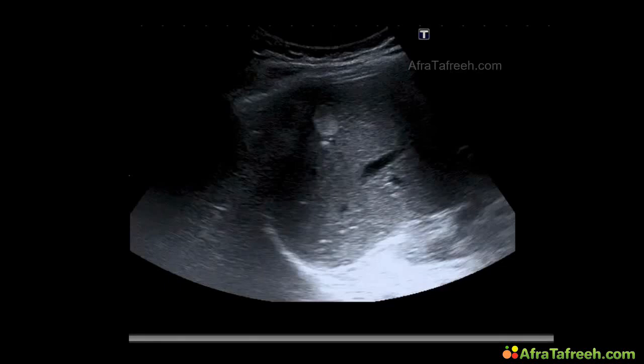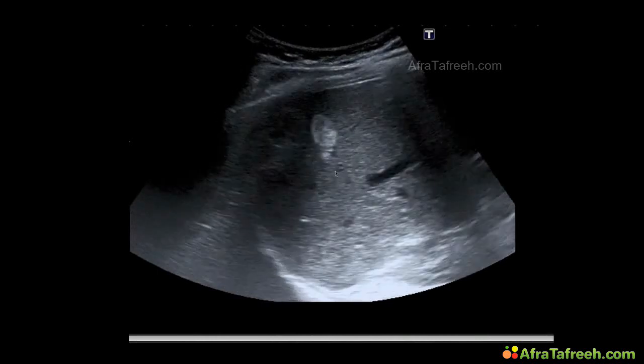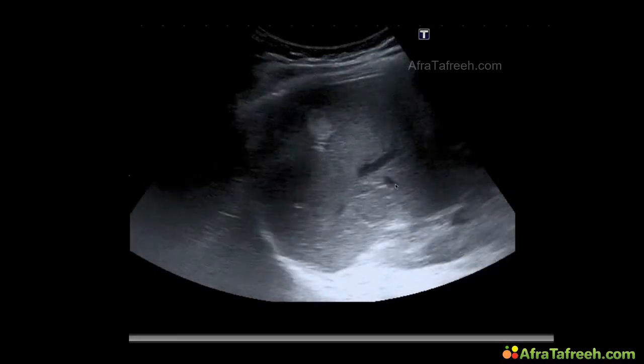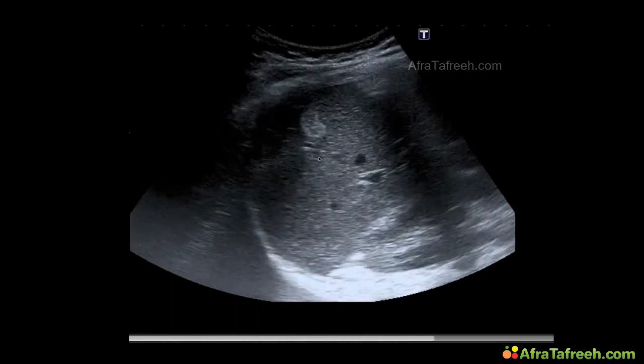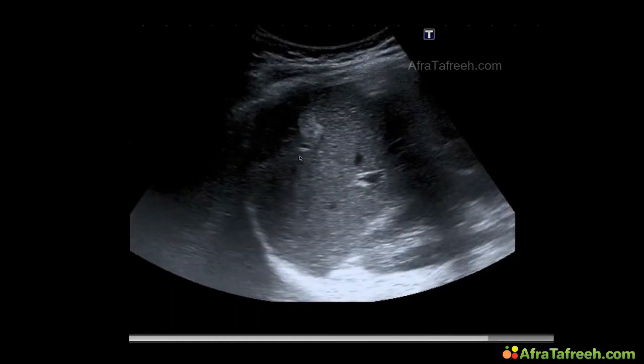Another video clip for you. Now I give you some time to detect it yourself. Yes, you're right. Over here, again, a hyperechoic lesion, a typical liver hemangioma.